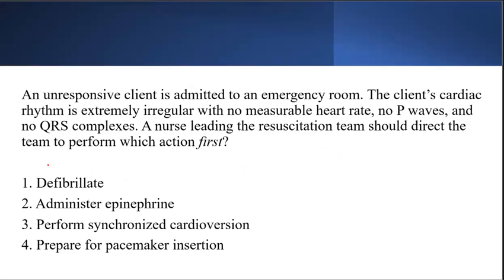Okay, so how about this? Assume you've read the question: no measurable heart rate, no P wave, no QRS complex. This client is in a possible cardiac arrest. What do we need to do? We need to defibrillate.